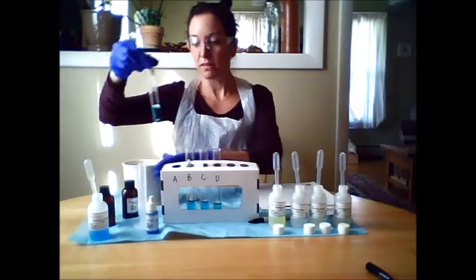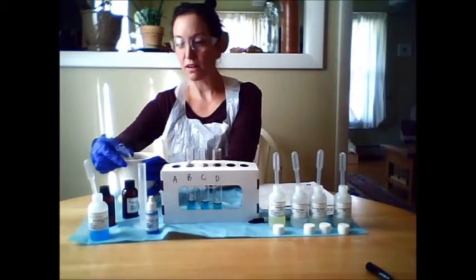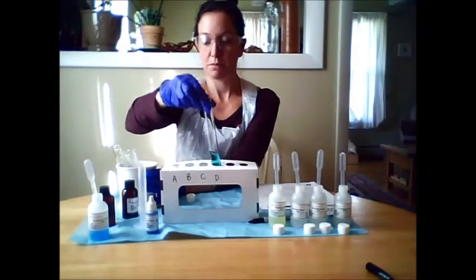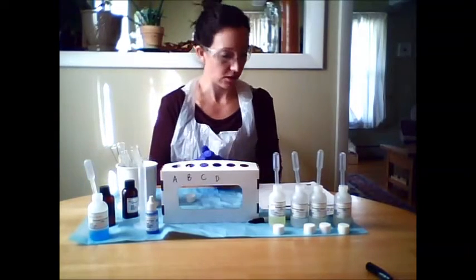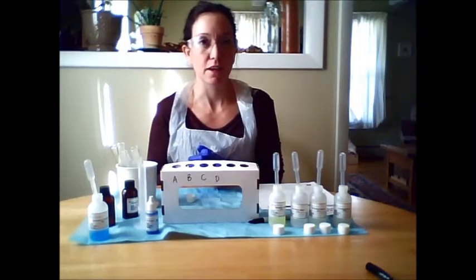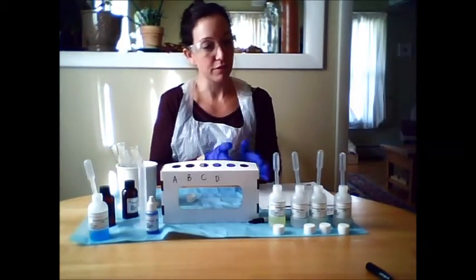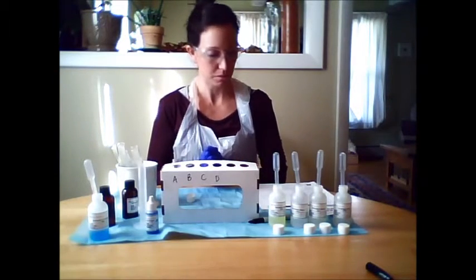We swirl to mix, and I have my hot water bath here. This is recently boiled water. And I will keep my test tubes in here for 3 minutes to see a color change, and record the color change in the table in the lab. Now this tests for glucose, sugar present in the urine. So in the first test we tested pH, and in this test we're testing for sugars.